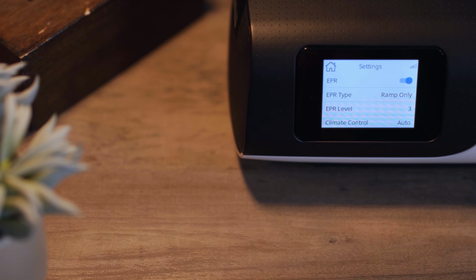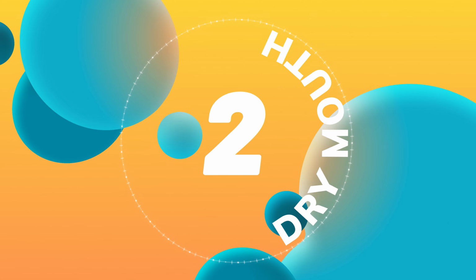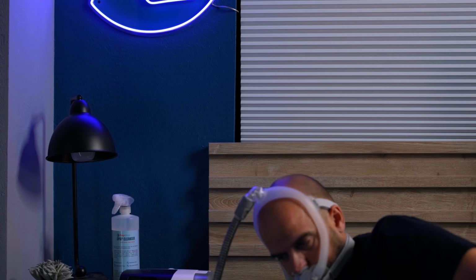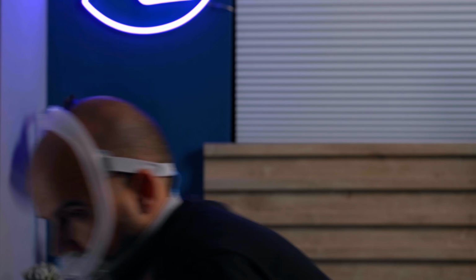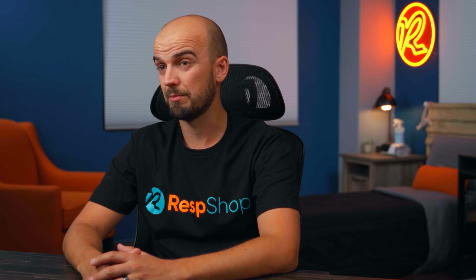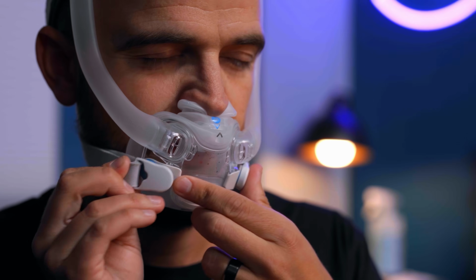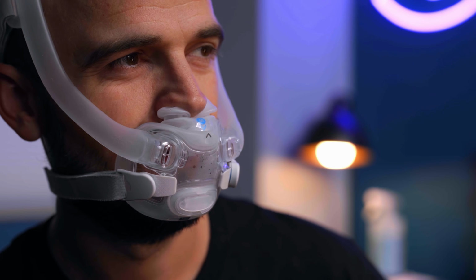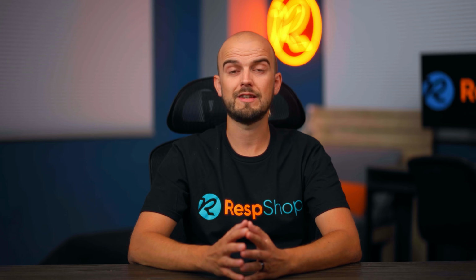Mouth breathing can also be a cause of stomach bloating, but I'll deal with that in the next one when I talk about problem number 2, dry mouth. Having a dry mouth in the morning is horrible, and it can also have associated health problems like tooth decay. The cause of it is actually pretty simple. High pressure air rushing through your upper airways, but especially your mouth. One thing to check straight away is whether you're breathing through your nose or your mouth. Breathing through your mouth is to be avoided if possible for this very reason.